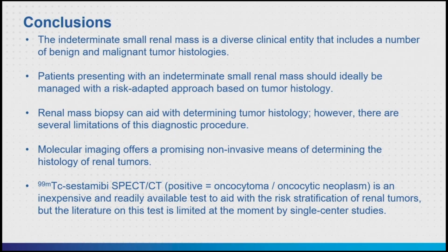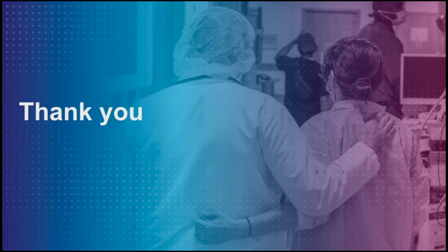Girentuximab is on the precipice of FDA approval. And once it's approved, you'll probably be hearing from TLX about how to order and use it in your clinical practice. But do consider the caveats that I've mentioned here, in particular the fact that a positive scan with girentuximab tells you that it's RCC, but with a negative scan, you still have the question of benign versus malignant. And that's it. Thank you.